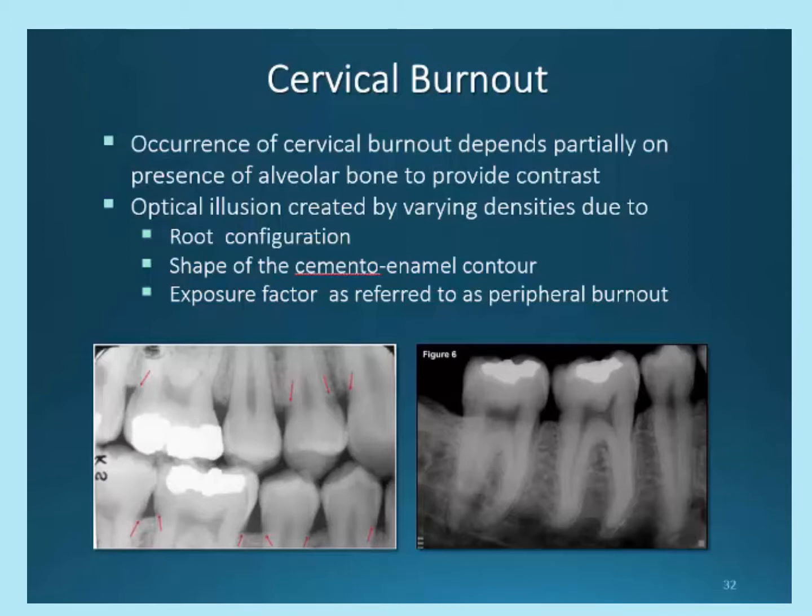I want to repeat myself. The tooth structure does exist, but because the density of this area is weak, radiation flies through these areas, passing through, giving them an image of void of tooth structure, and it's strictly an optical illusion. There is no decay present, and the tooth is sound. The shape of the tooth's contour may play a role in this condition, and it appears that it does not exist as it does on the radiograph image.